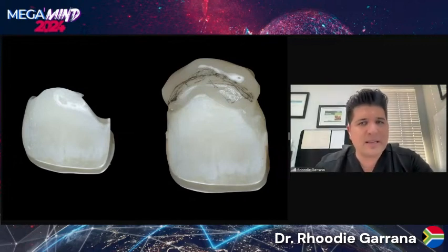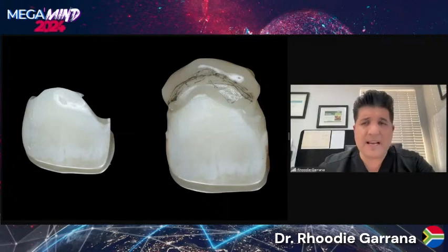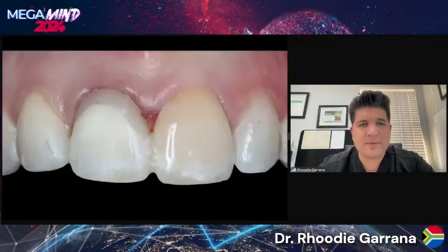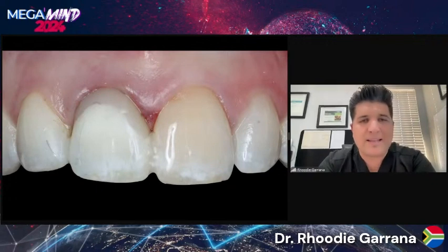So I took the tooth that we had sectioned off, and I added some composite, and I used the pencil to mark off where I wanted my zenith point to be. And these photos are very rough of when I first started. And then I bonded the crown back to the adjacent teeth in place at the ideal position, highly polished composite, to stimulate hemidesmosomal attachment to that area.